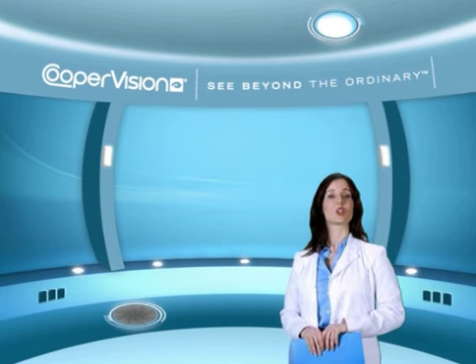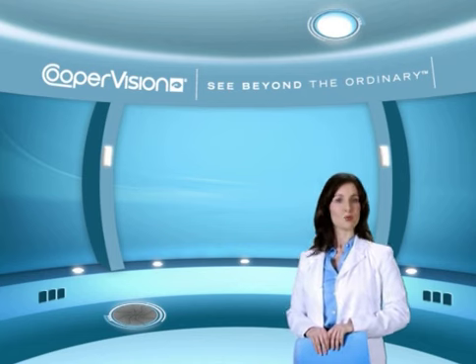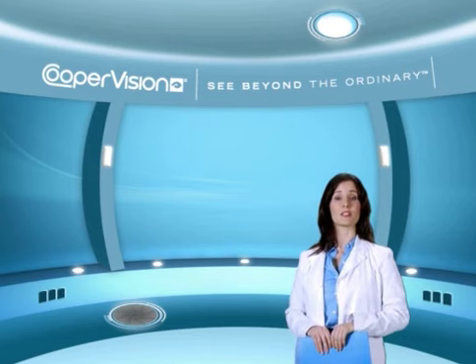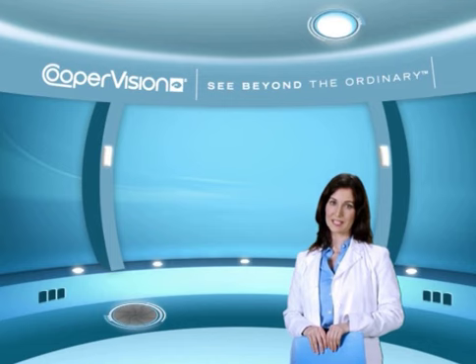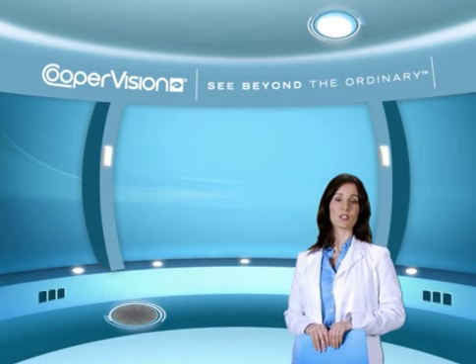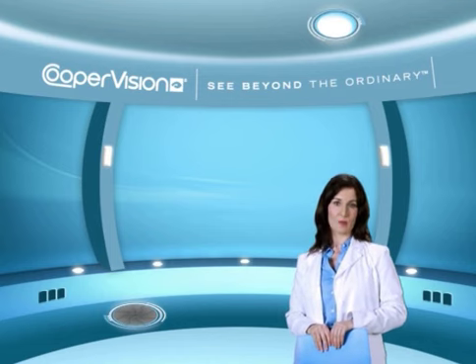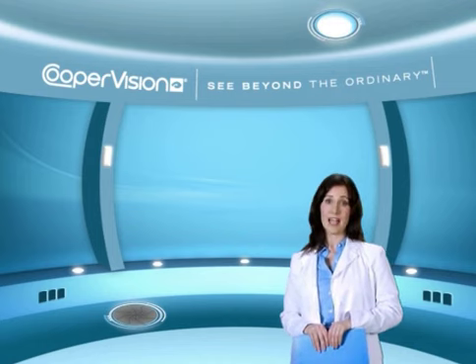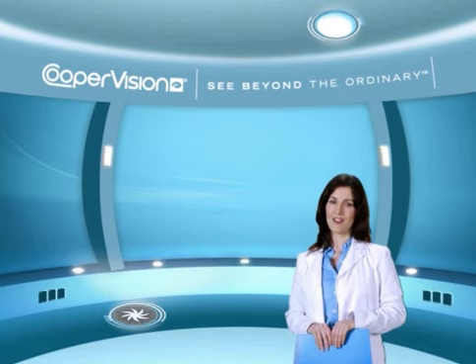During the next few minutes, you'll learn what we feel is the best way to insert your contact lenses. Please remember that this demonstration is to be used only as a guide. Be sure to follow the lens care procedures recommended by your eye care practitioner, and make sure to read and follow the directions that come with your lens care product. For any questions, contact your eye care practitioner.